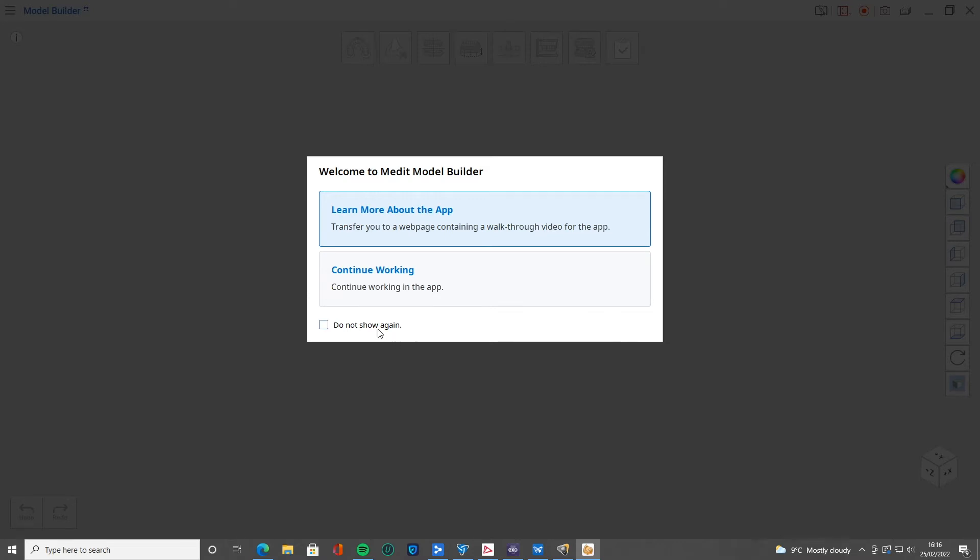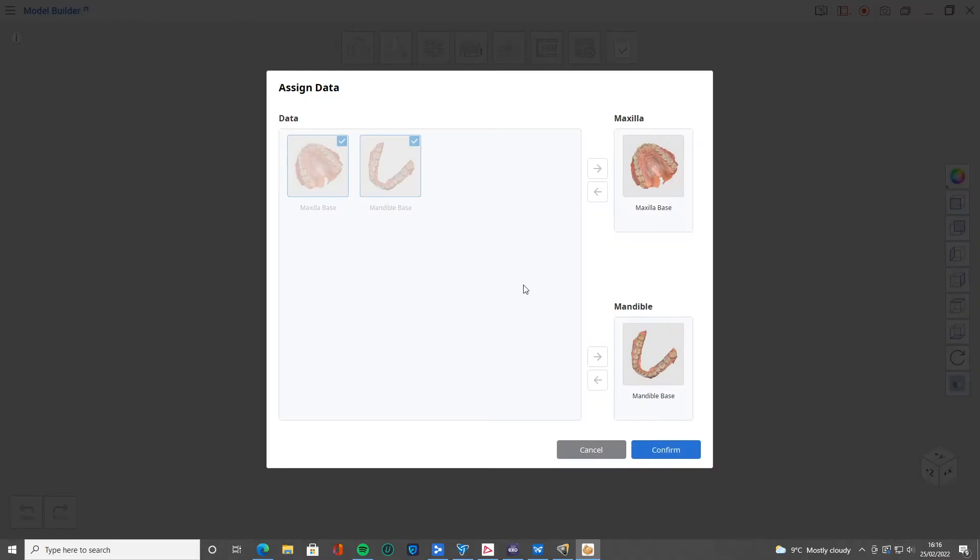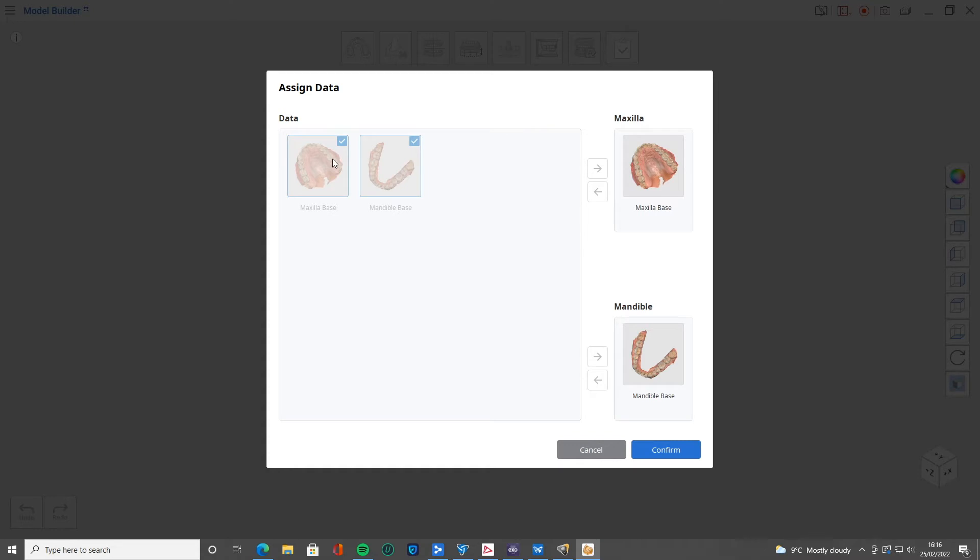The first step is we're going to assign the data to this maxillary model. If you've got more than the upper and lower scans here, then you might choose whichever one you want to make the model of. Say you've got a pre-op scan or what have you. We've just got the two scans in this case, so I'm just going to click confirm.